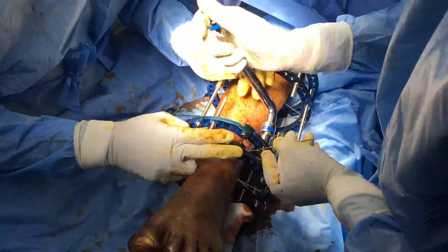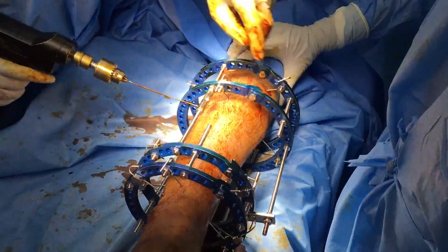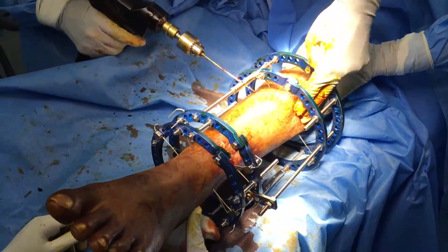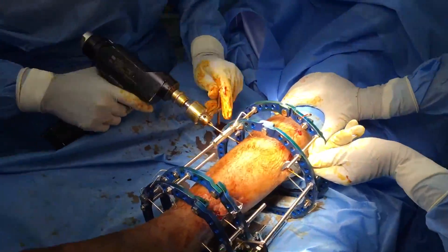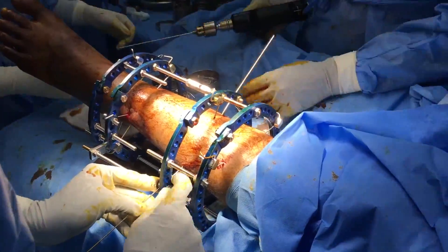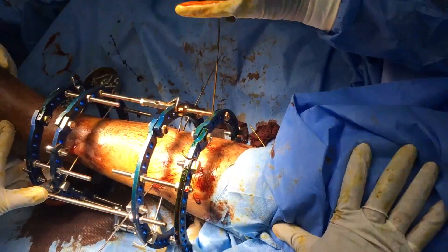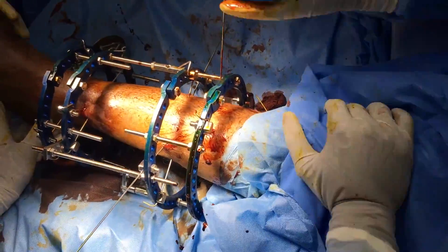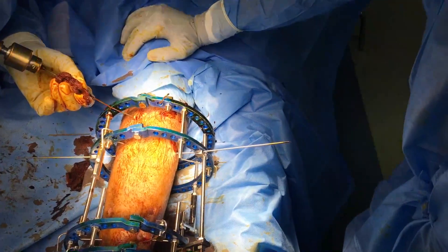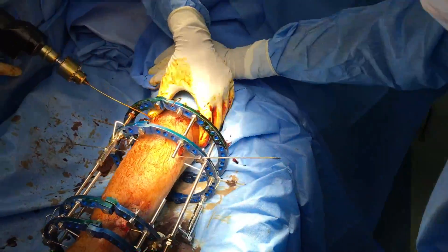We are now left with an elegant lightweight frame with less than 8 wires through various corridors of the tibia. These are 1.8 mm wires and their subsequent removal will leave the patient with absolutely no scar. The key to success of this surgery is knowing the anatomical corridors that are safe to pass K-wires.